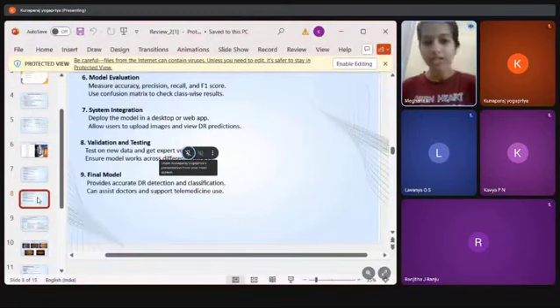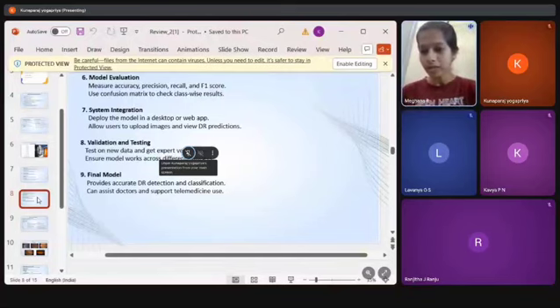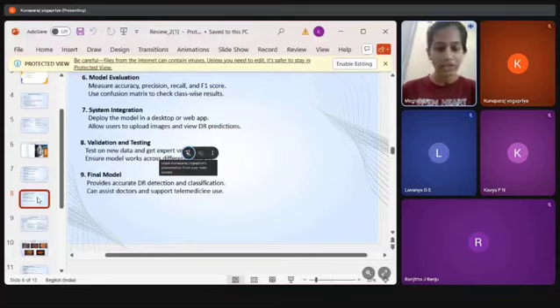The eighth step is validation and testing. The final model is evaluated on an independent test set that was not seen during training, with real-world testing using data from different hospitals and sources. We can contact expert ophthalmologists who can validate results for clinical relevance, ma'am. The final, ninth step is final DR classification. Once all these steps are done, the output is a fully trained, validated, and integrated deep learning model which can detect and classify diabetic retinopathy stages accurately, and serves as a diagnostic aid for ophthalmologists, ma'am.